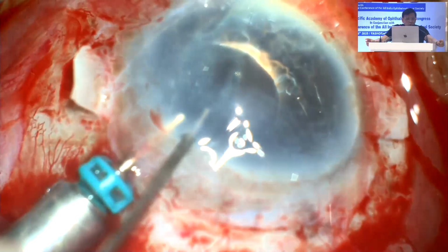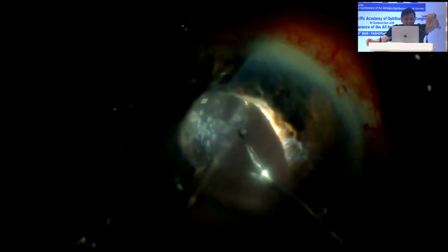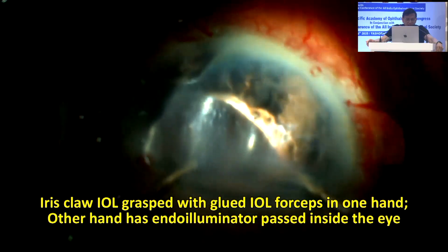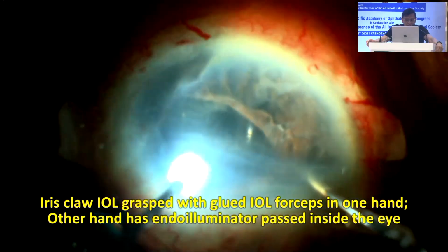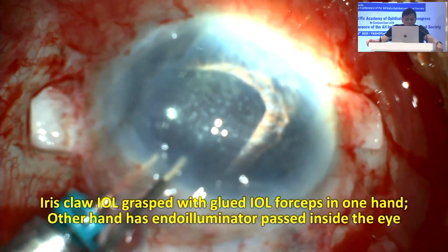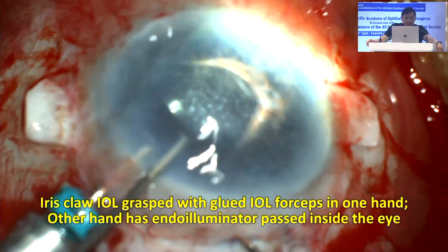Now you see an iris claw lens. One haptic is stuck to the iris, one is dangling down there. So using one hand, I've caught that IOL. In one hand, I've got an endoilluminator, other hand, I've got the forceps. I'll now gradually bring that IOL anteriorly.